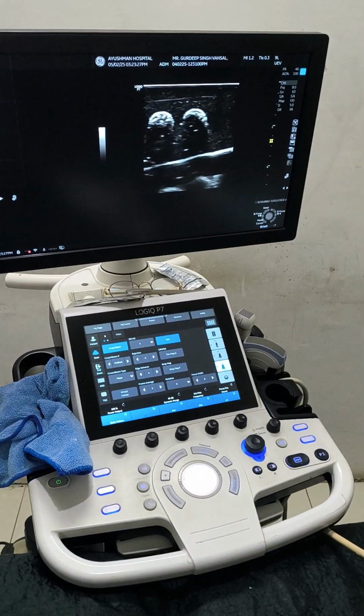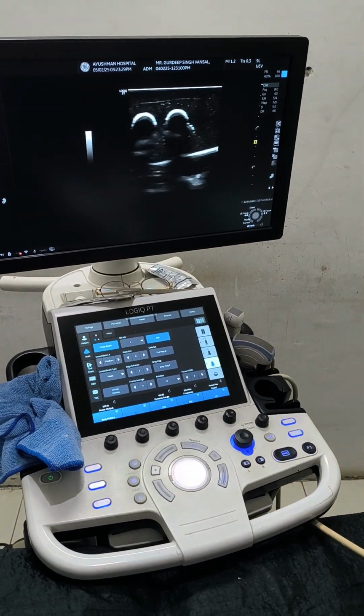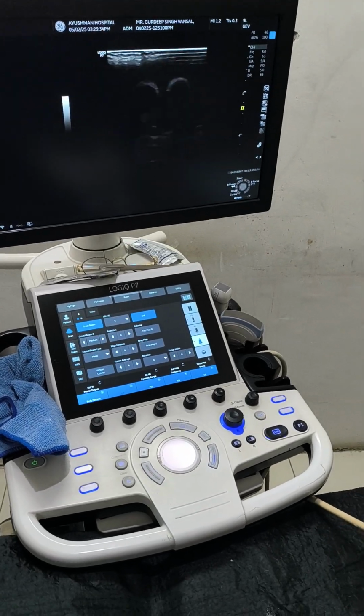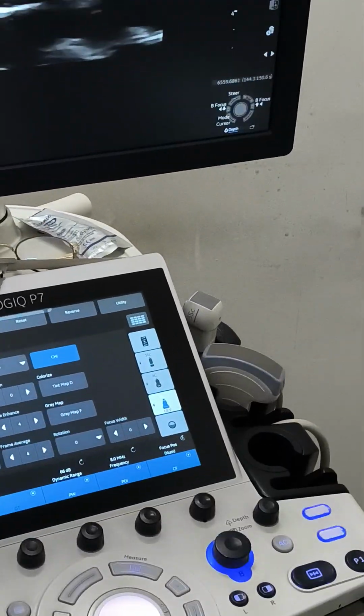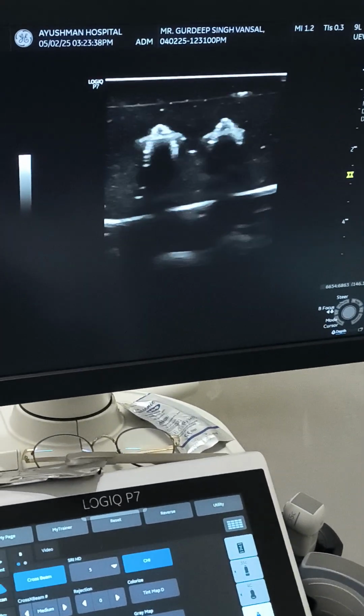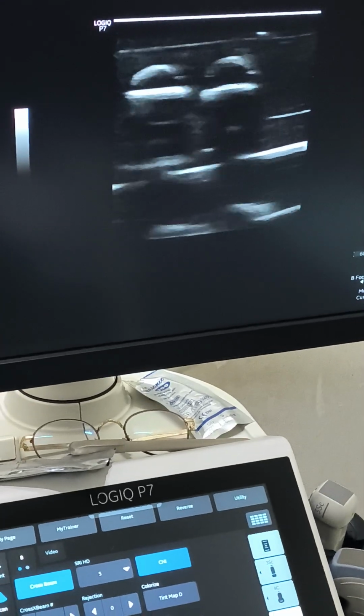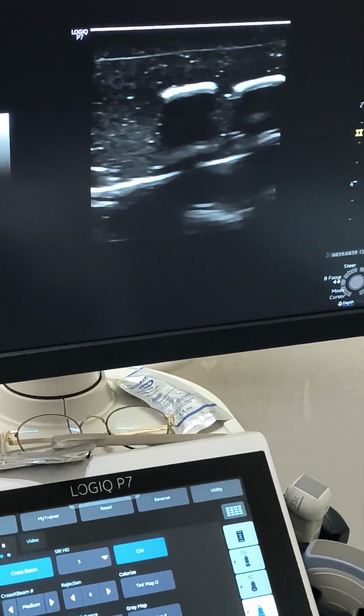So these are the ribs. Okay, you see semicircular rib and a little bit more medial, and then you see the transverse processes. So these are the transverse processes, and then further medial, these are the spinous processes, right? So now we have to go to the tip of our transverse process or TP.